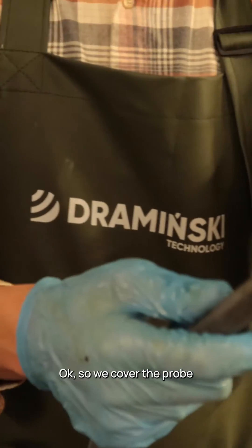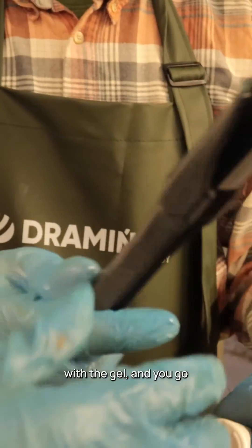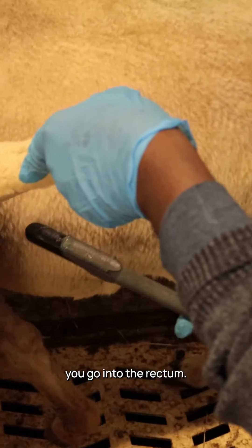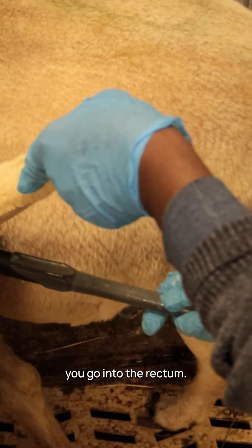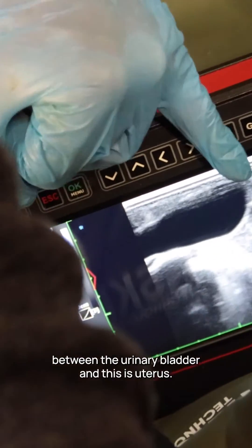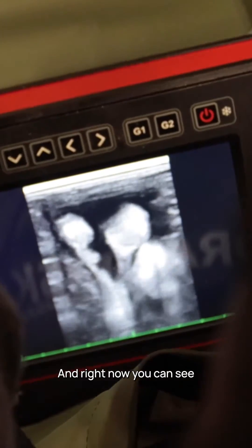We cover the probe with gel and go into the rectum. You can see how quickly you can define between the urinary bladder and the uterus.